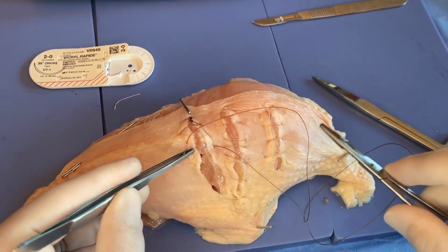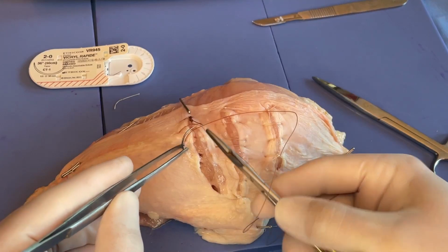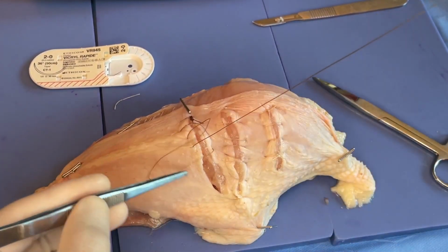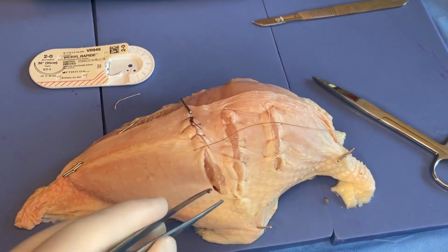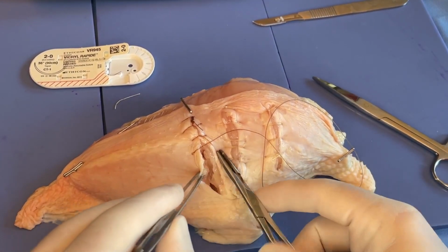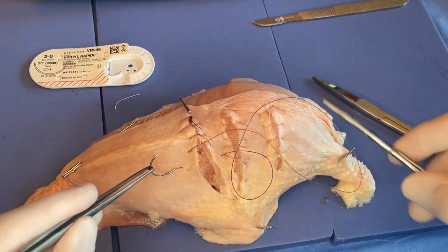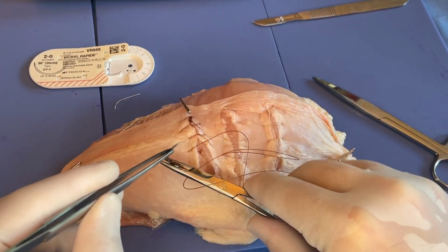And then one of the things we can do is I can just bring my needle driver through this loop right off the bat. And then as I reload the tissue, I'm pulling it right through the loop in the first place. So again, see that good compression there. So again, we just go down, see the tip of our needle, come across in one, curve it out with the forceps, reload at the tissue. But instead of just doing that, I want to come through the loop itself to reload.